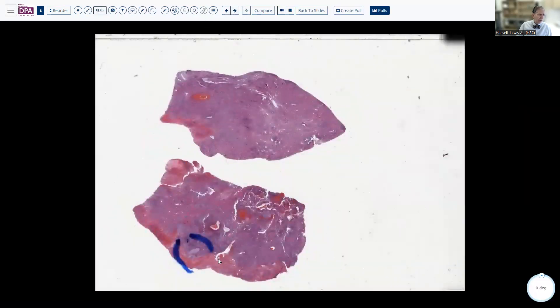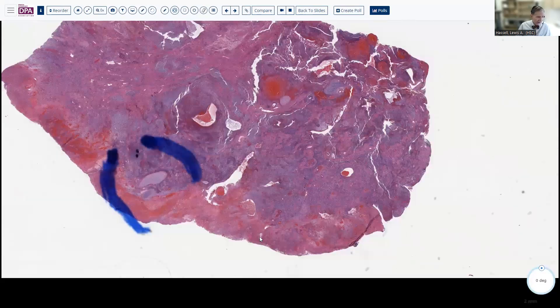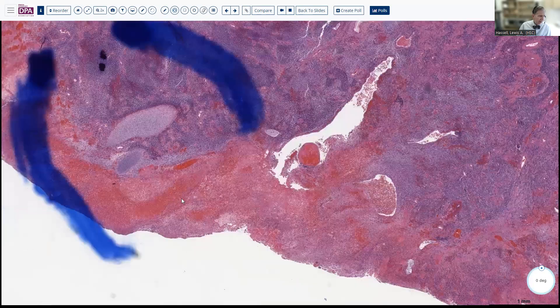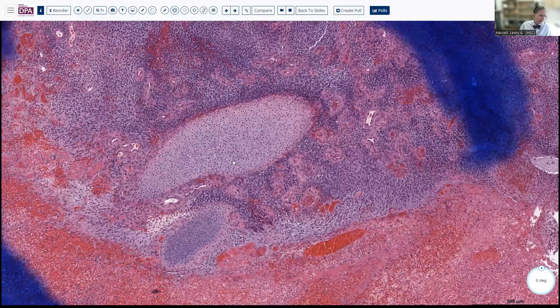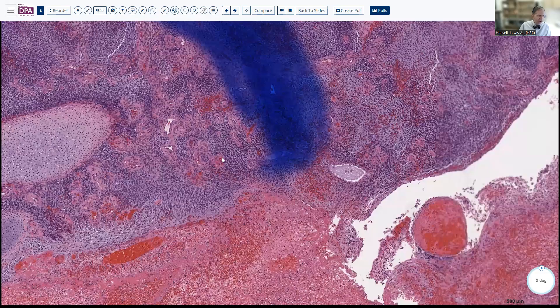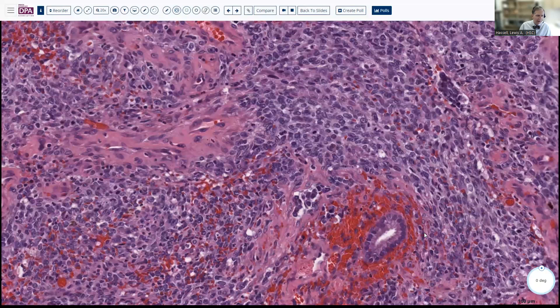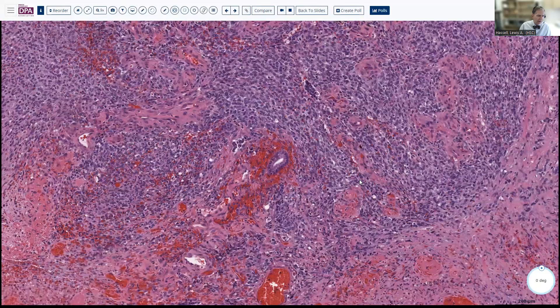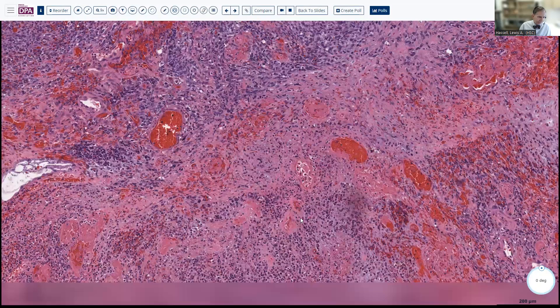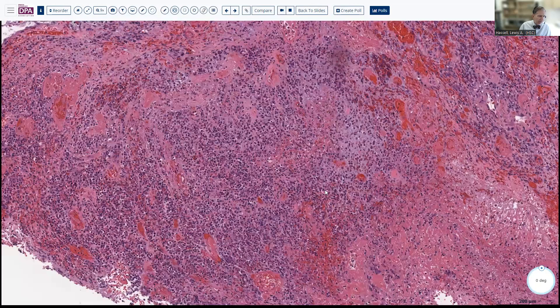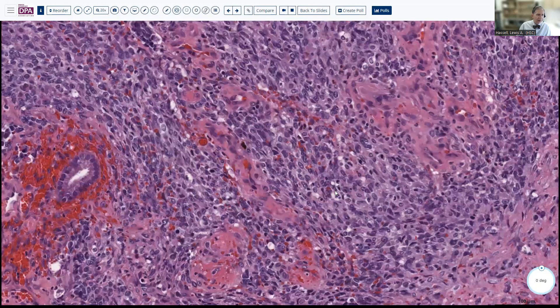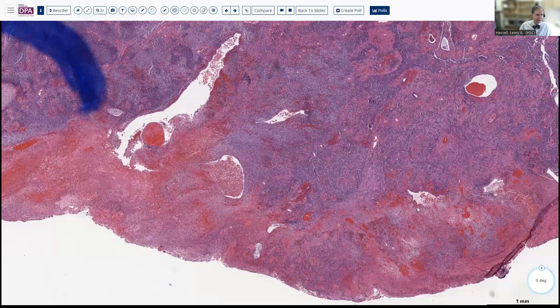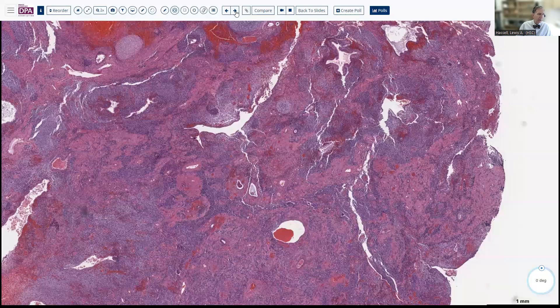Here's a polypoid mass. You can see the surface hyperemia, but in this case there's altered differentiation with some chondroid tissue. As you look at this stroma, it shows a much higher degree of cellularity, atypia, and mitotic activity, along with very benign trapped glands. There's a very inflamed and eroded surface, but underneath that surface is a cellular neoplastic proliferation with telltale heterologous elements. In this case, that indicated an embryonal rhabdomyosarcoma.